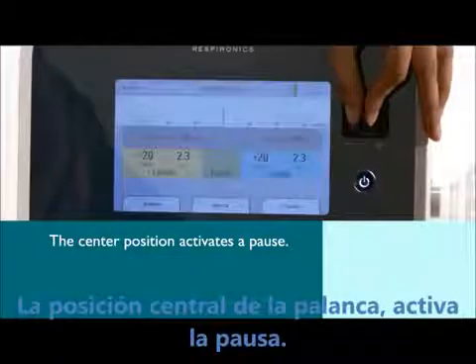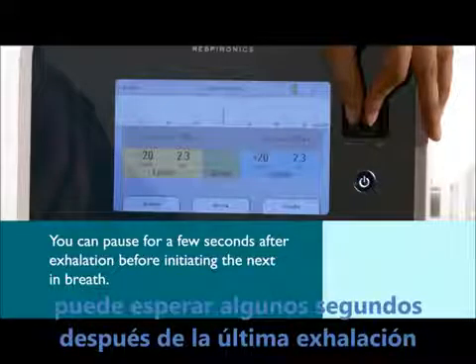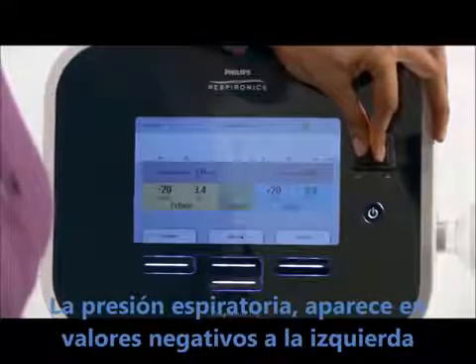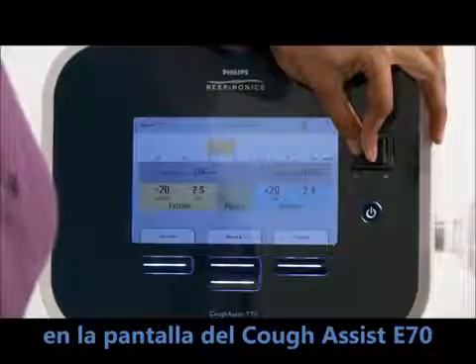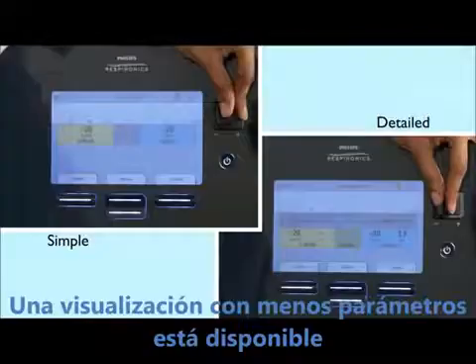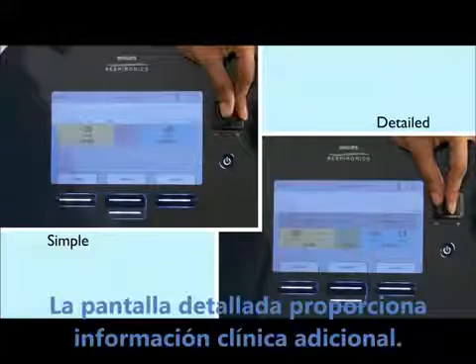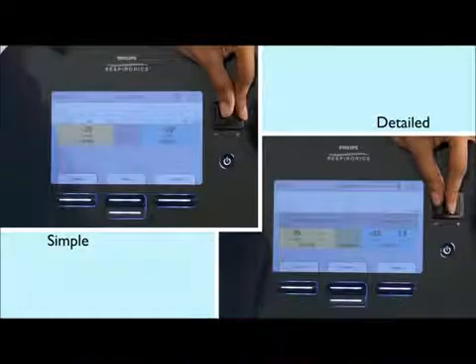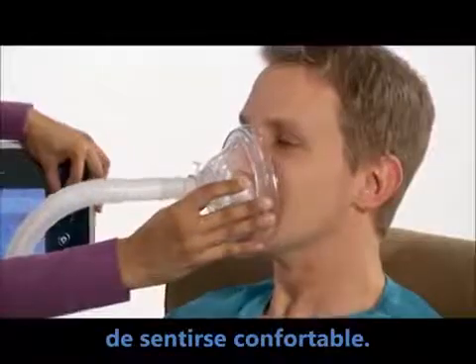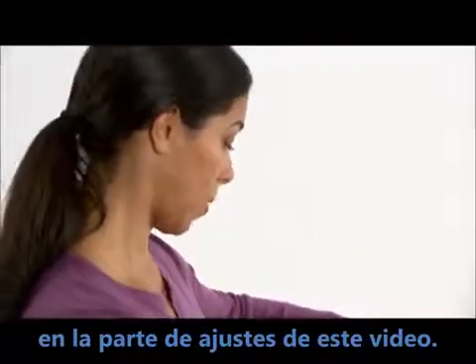The center position on the lever activates a pause. Depending on patient preference, you can pause for a few seconds after exhalation before initiating the next in-breath. Exhalation pressures appear on the left as negative numbers on the CoughAssist E70 screen; inhalations are shown as positive. Both appear in real-time. A simple screen view with less respiratory information is also available through menu options, while the detailed screen provides additional clinical information. For the initial treatment, you may want to begin with lower pressures to give the patient a chance to get comfortable, and you can gradually increase pressure as described in the pressure and timing adjustment portion of this program.